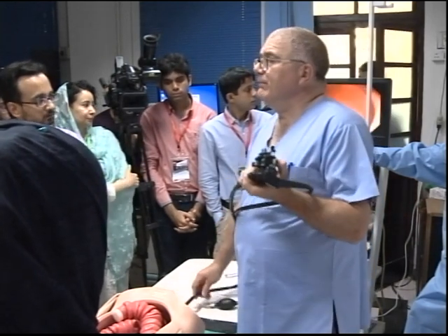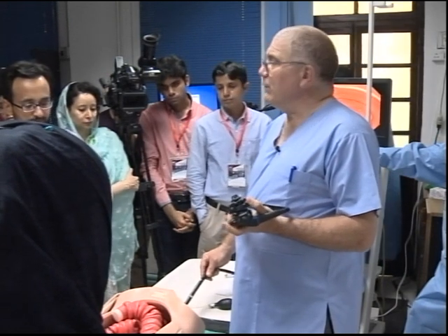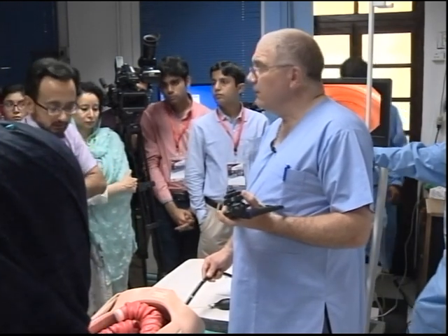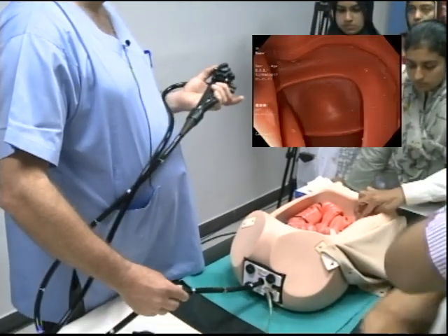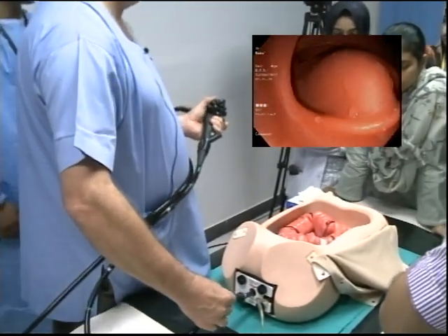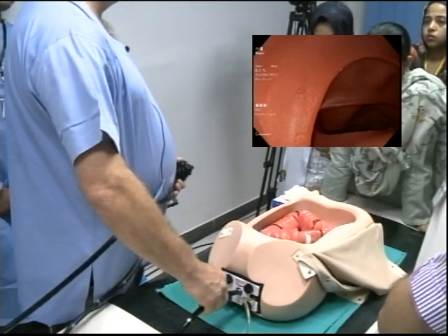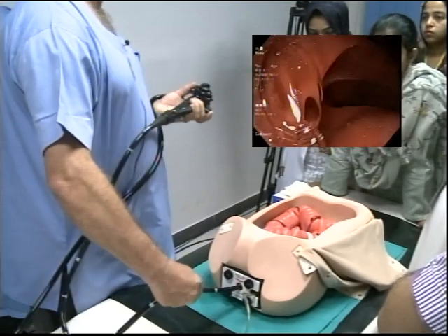But what we want you to do is scope the way you would normally scope. At this point, I would suck. So you suck on down. Can you do this angle, please? I've done it. I'm in the mid-transverse. But can you explain it again? Anti-clockwise. So you come forward rather than clockwise. If you go clockwise, you will disappear underneath. Right? So we come down. As it goes forward, if you could just step back just a fraction. Your shoulders are in the way, boys.